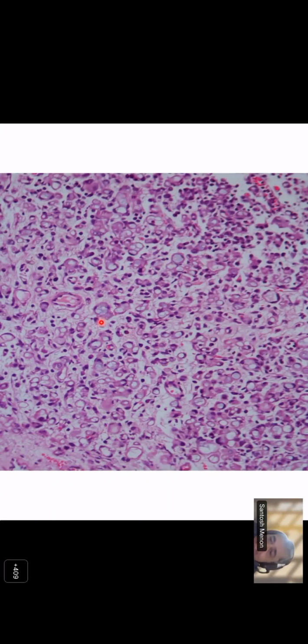If you look at this, they have this capillary-like appearance, but they have this thickened, basement membrane-like material, which is a little hyalinized. They look like thick endothelial cells or thick capillary walls, and that is very characteristic for picking up the finding of nephrogenic adenoma. Classically, they are PAX8 positive. They are supposed to be renal tubular cells which are shed from renal tubules and get implanted in the bladder or in the urogenital tract.